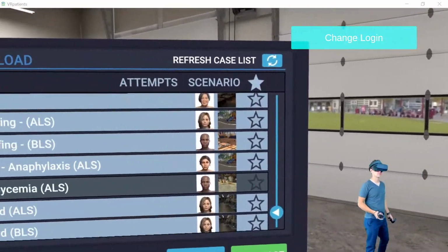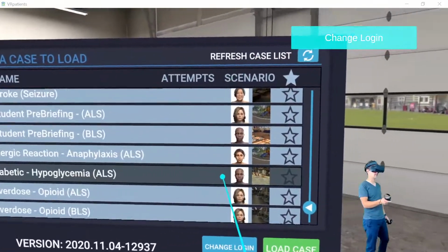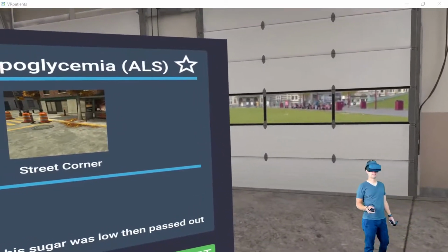So heads up, because this one's going to be shocking. You see what I did there? Shocking, pads, leads, yeah?